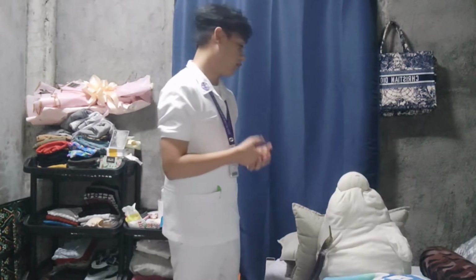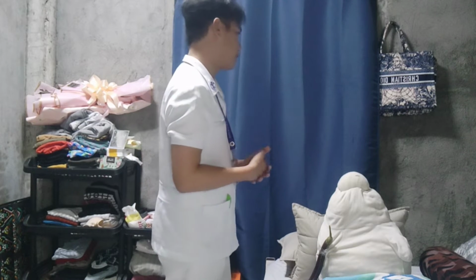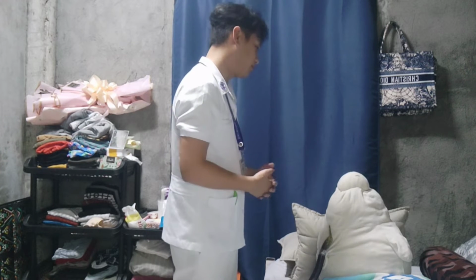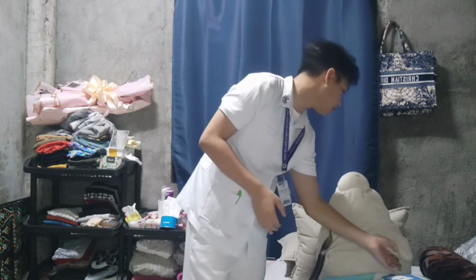So, prior to performing the procedure, introduce self and verify the client's identity using the agency protocol. This is to verify that the administration of medicine is being rendered to the right patient, and this is also to establish rapport with the patient. Good day, ma'am. My name is Christopher Denaque. Before I explain, may I ask your name or your birthday?